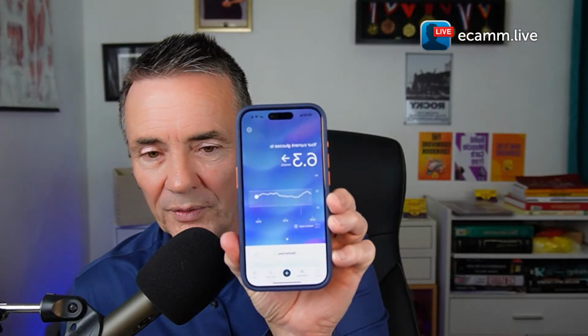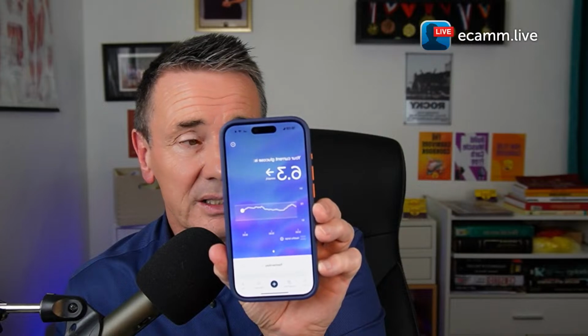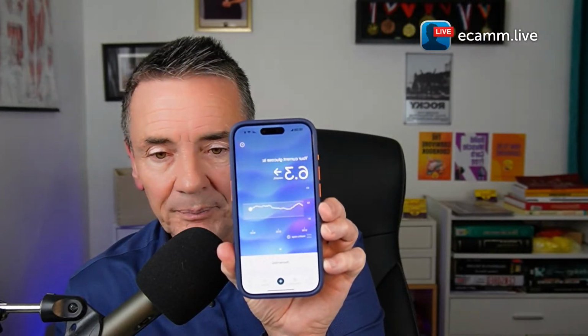I'm just going to show you on my phone right now where it is, because it's interesting. If you look at the screen there, hopefully you can see that it's 6.3 now, which is not great. That's about 110. So what's just happened has made me get to 6.3.